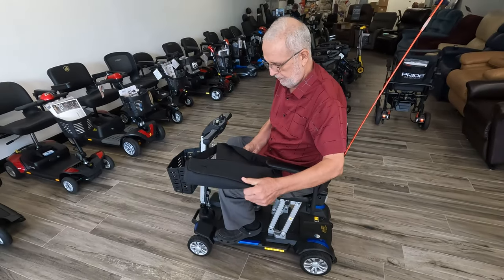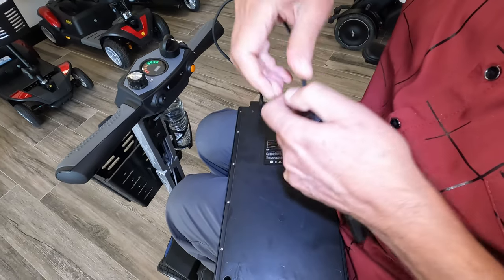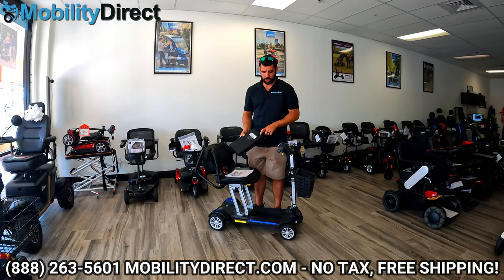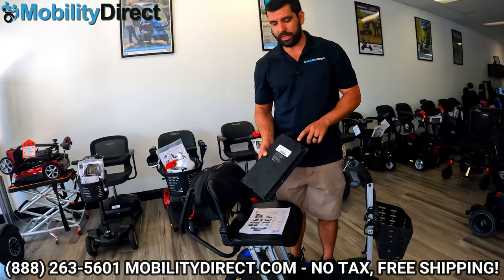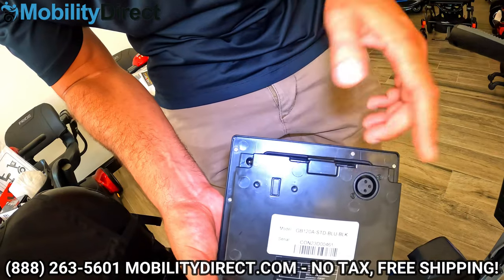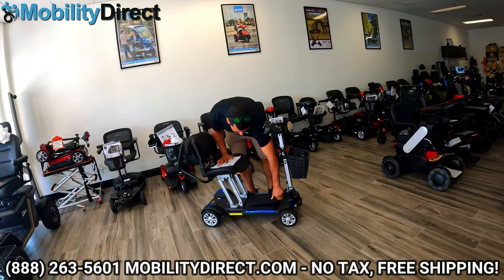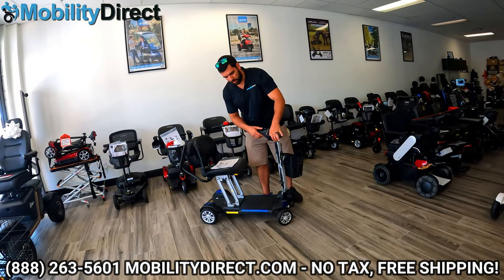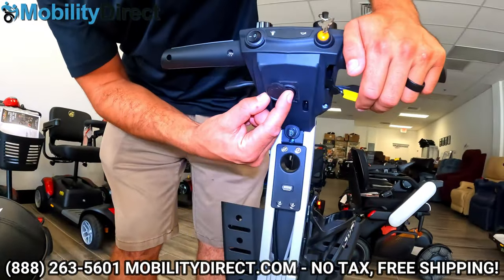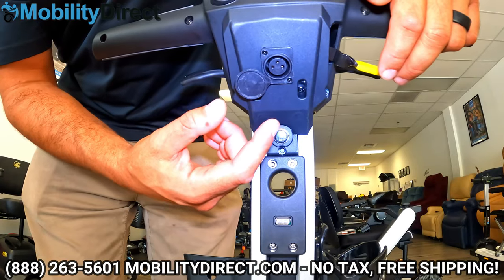The TSA battery has a USB charging port on it. The regular-sized battery is a little bit heavier and does not have a USB charging port, but it does have a charging port for the charger. You can charge the battery while it's connected to the scooter using the charging port on the steering column, or you can plug it right into the battery if you leave your scooter in the trunk of your car and want to charge the battery inside your home. You also have a secondary charging port — underneath the tiller console there's a little cover, and that's the XLR charging port.